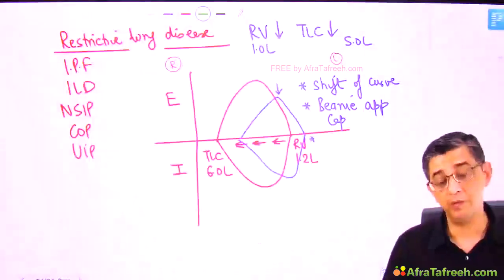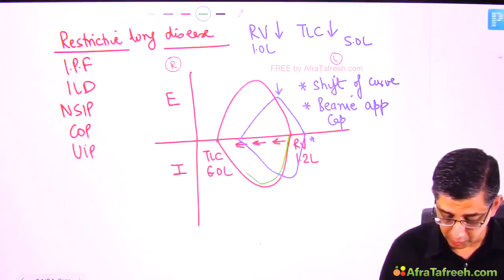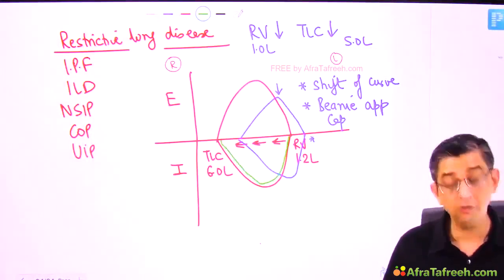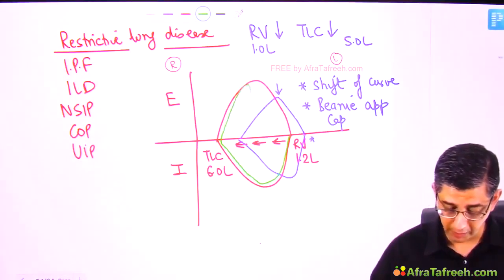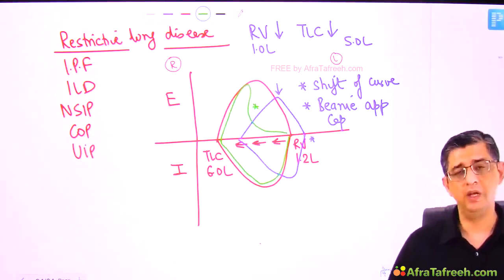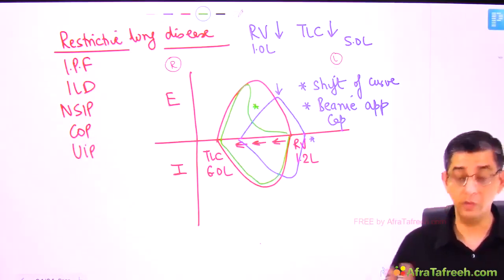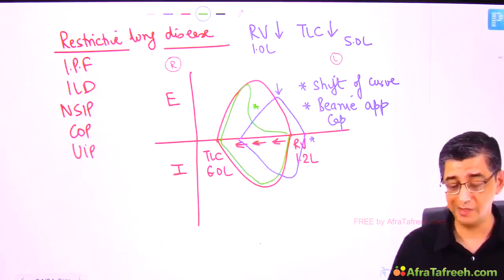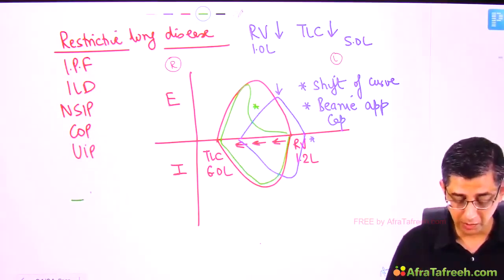I will now use a different color. In green color, I'm representing what is going to be the representation for asthma. This diagram, you can either take a snapshot, or rather hand draw with me, because if it's going to be an asthmatic, this part will definitely exhibit a very significant concavity. Guys, flow volume curves are so simple that even technicians can interpret it. So you guys are anyway qualified people. For you guys, this is going to be a piece of cake. Here, the green color is representing obstructive airway disorder, that is bronchial asthma.